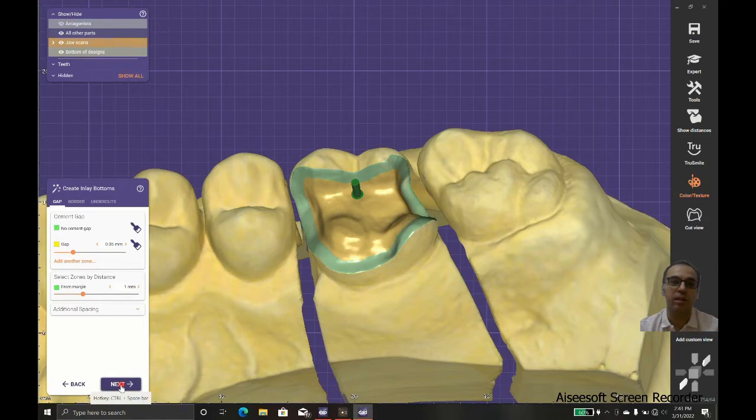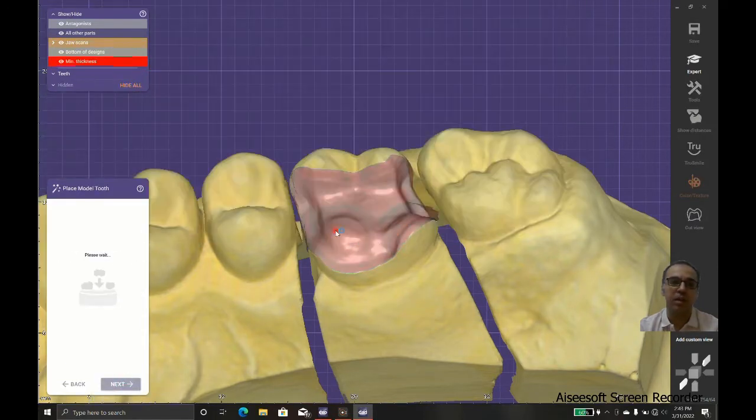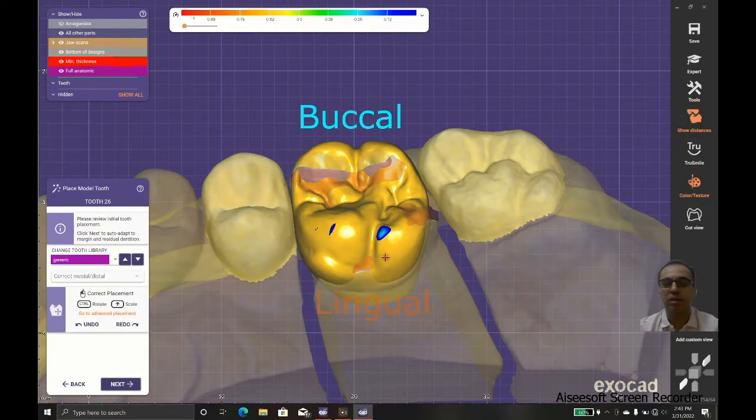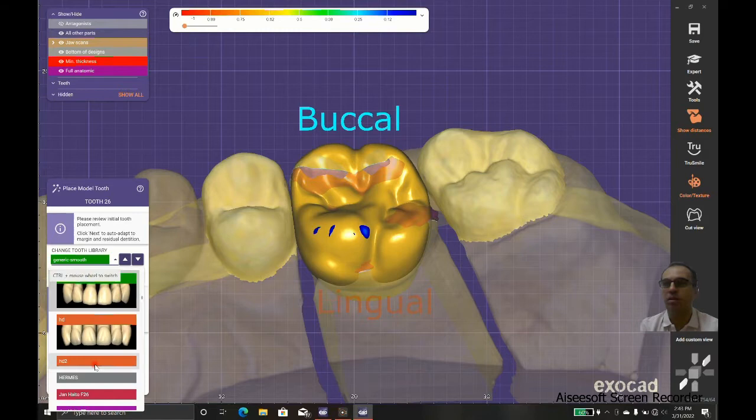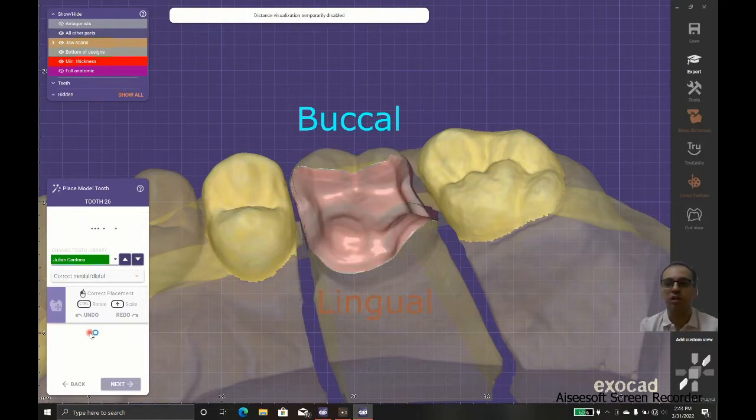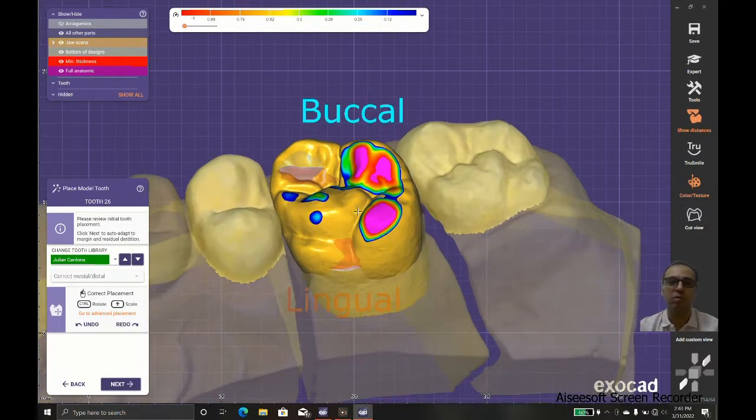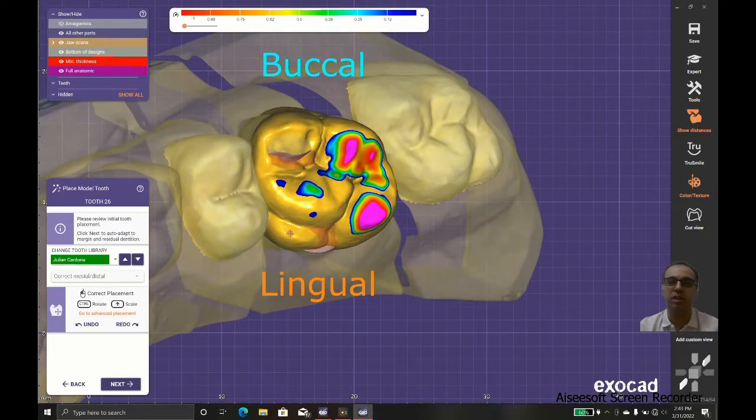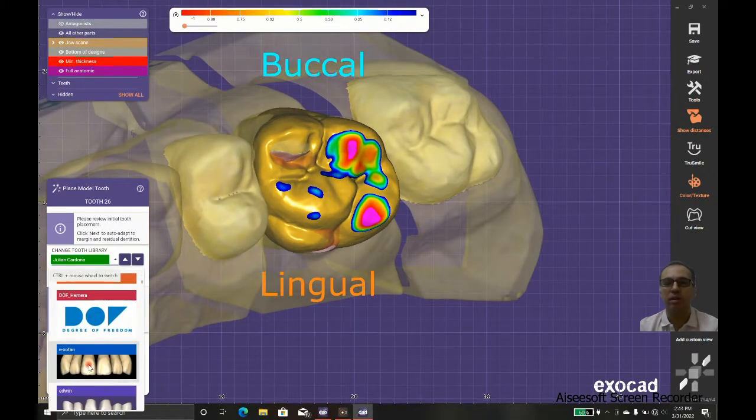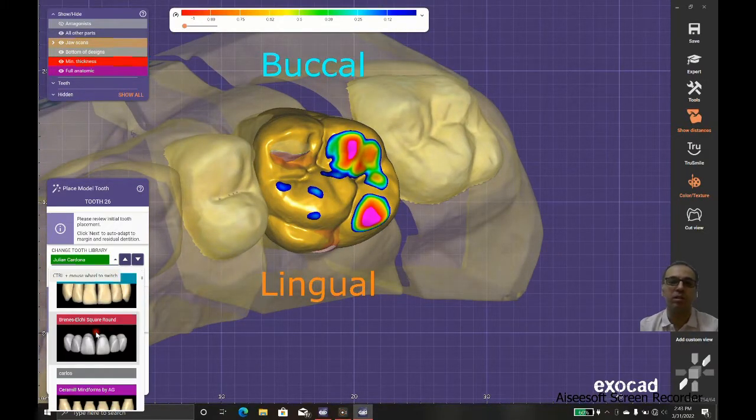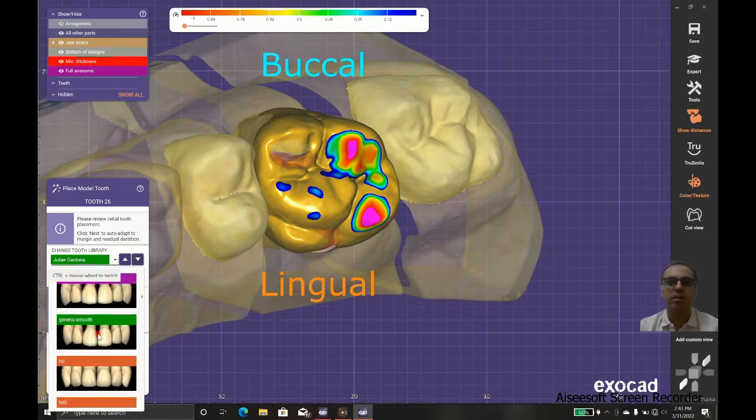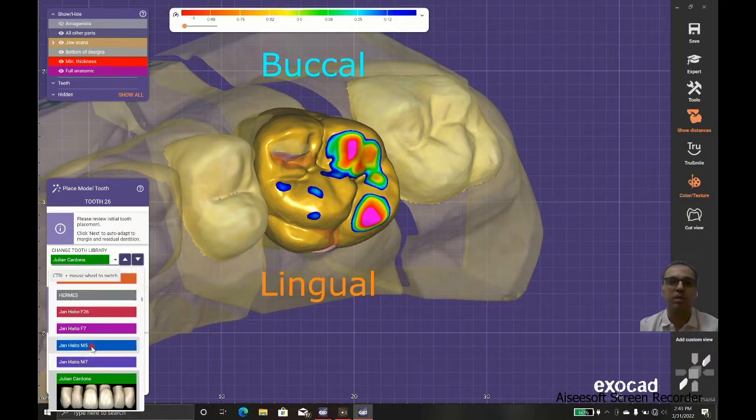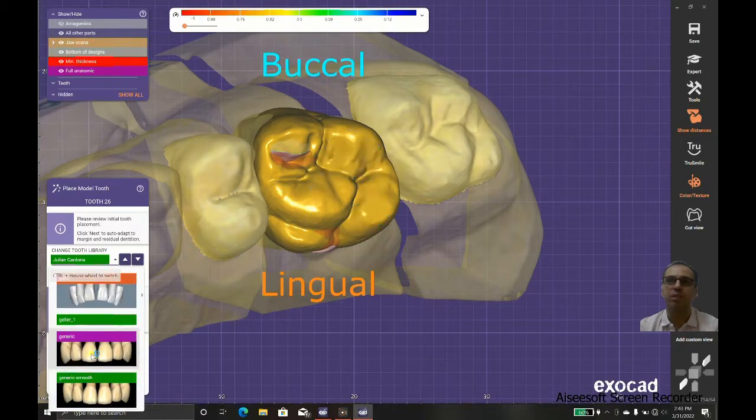We should use the library. Most of the cases, me and my colleagues use Generic or Generic Smooth. These two libraries are so useful and they scale well, they have good anatomy, but to be honest, it's not so professional looking and it doesn't fit every case.